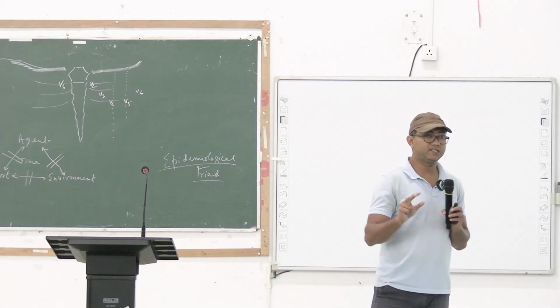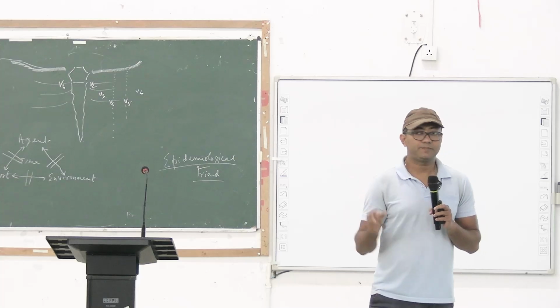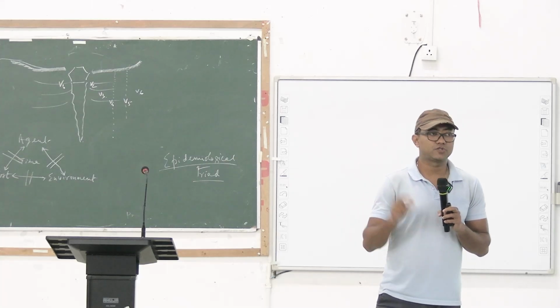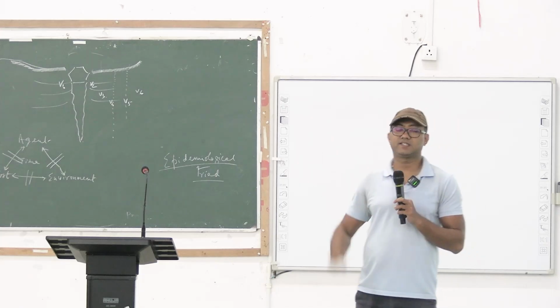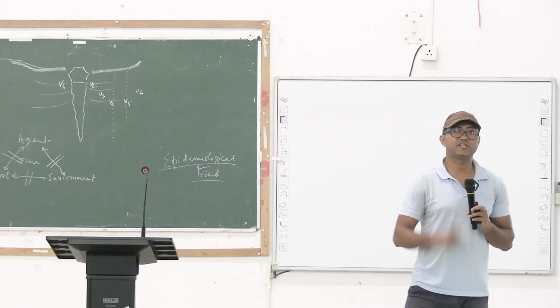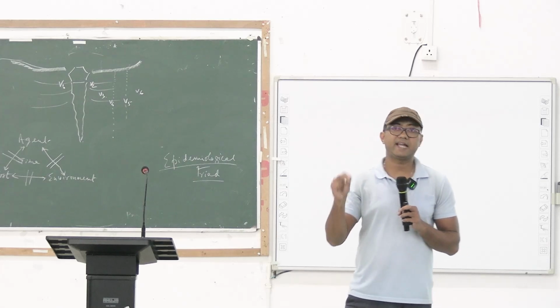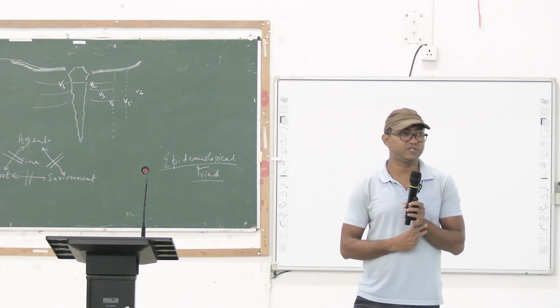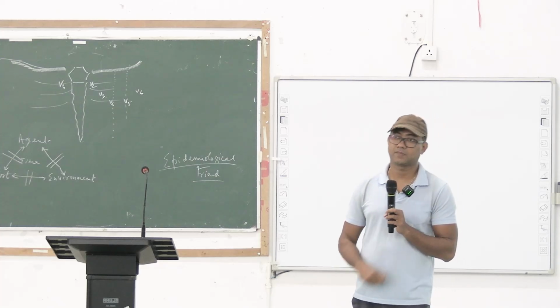By the definition of lead, a lead is a pair of electrodes which measure potential difference between 2 points. So, a lead must be bipolar, right? In the case of chest leads, it measures potential difference between the point where the lead is attached and another point which is located in the machine, called the neutral point, right.